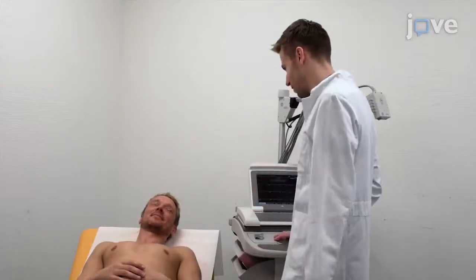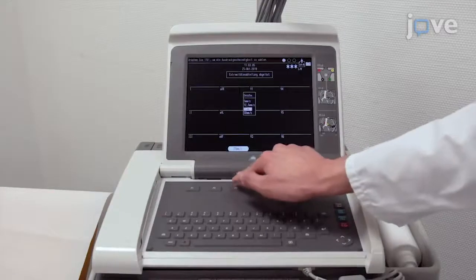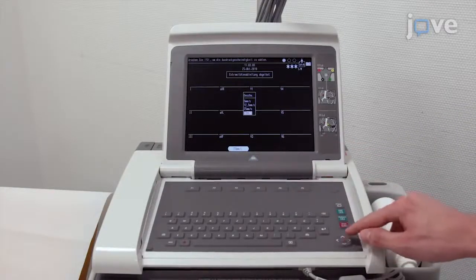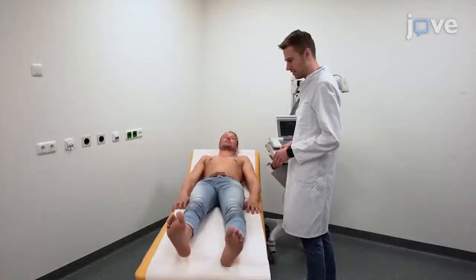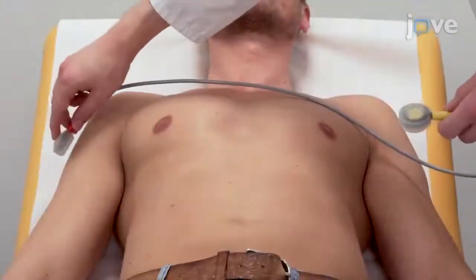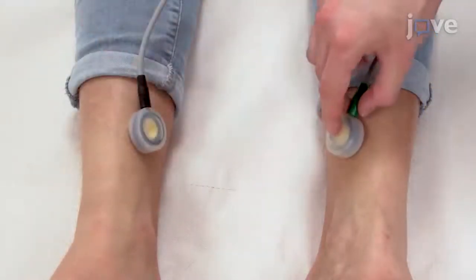To record a standard ECG, use a common ECG device and adjust the paper running speed to 50 millimeters per second. Perform the recording after a five-minute resting period in a supine position. Place the right and left arm electrodes near the shoulders and the right and left leg electrodes near the ankles.